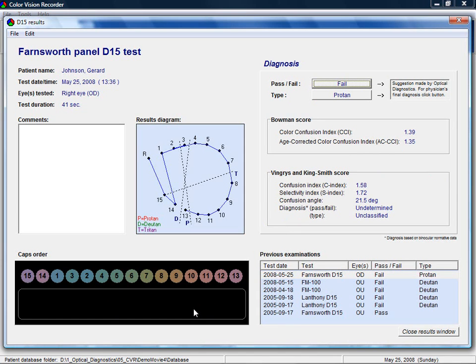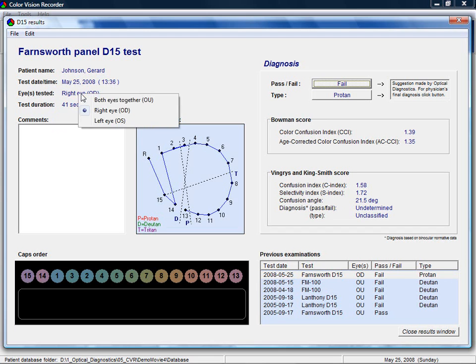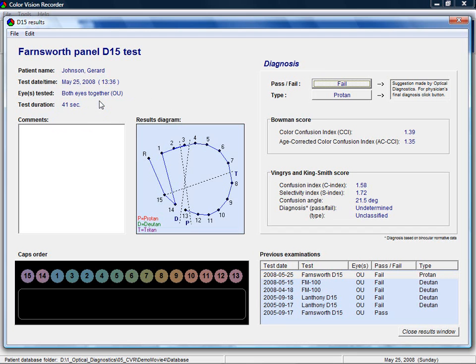The results window contains information such as the date, time, eye tested, and duration of the examination. Clicking on most data allows you to change it. There is also a box to enter additional information about the test.